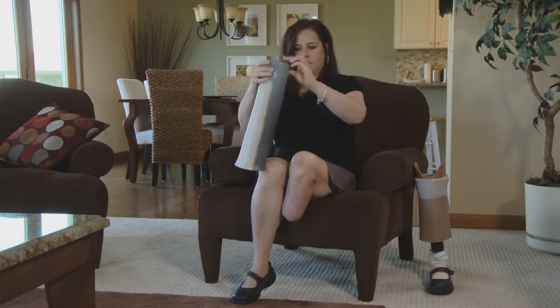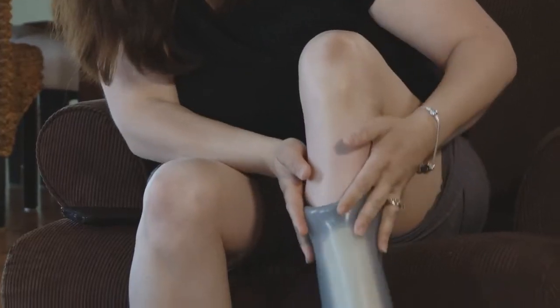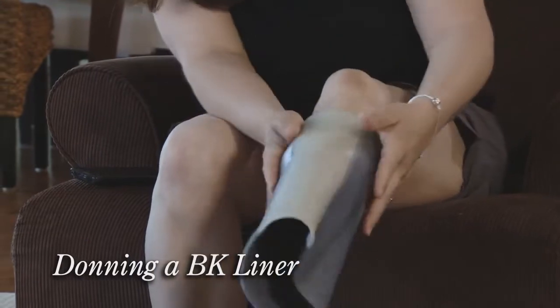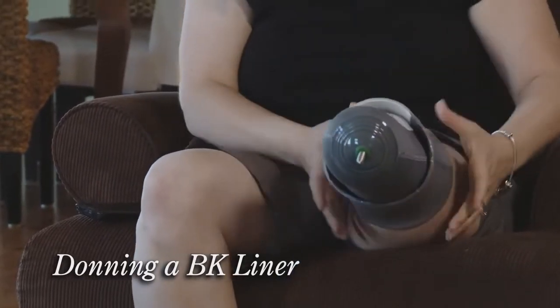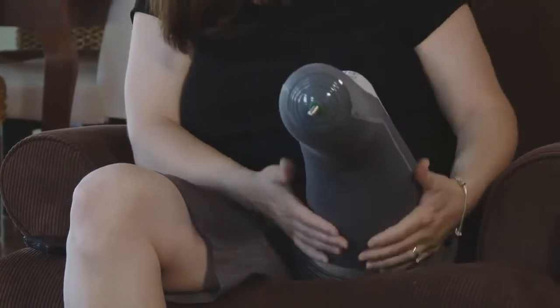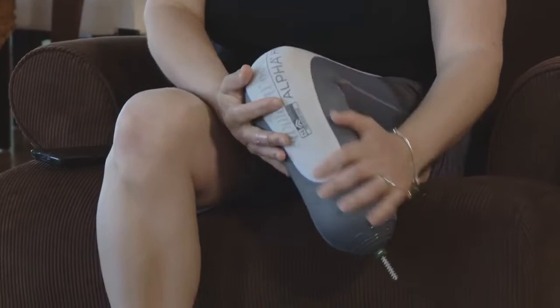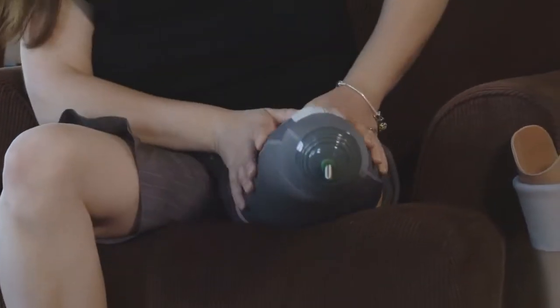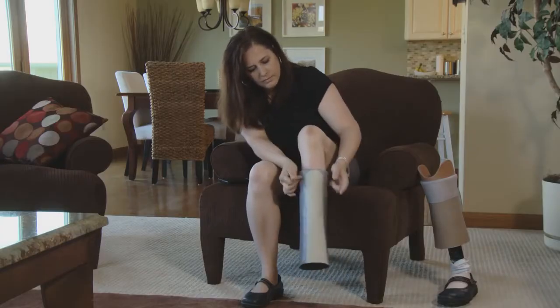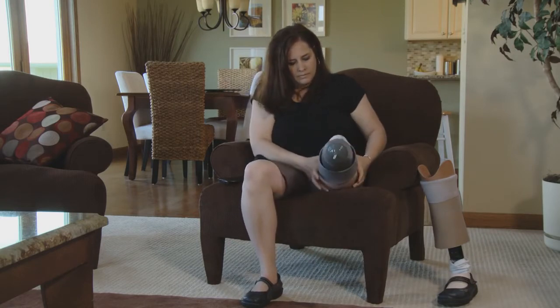To don your Alpha Liner, begin by inverting the liner so that the gel side is facing out, and place the end of the liner against the end of your limb. If you are a below-knee amputee, the logo and serial number of your liner should be in the front. If you are using a locking liner, be sure to center the pin attachment on the distal end of the limb. Carefully roll the liner up onto your residual limb with the gel side against the skin.